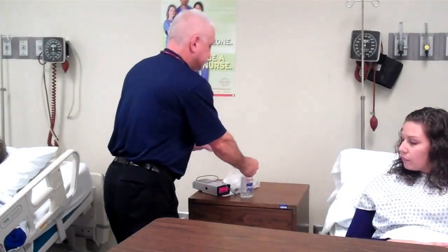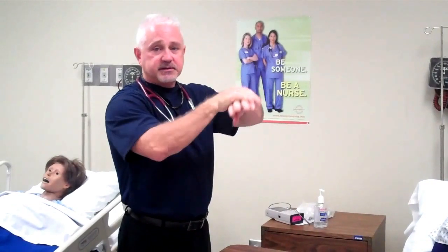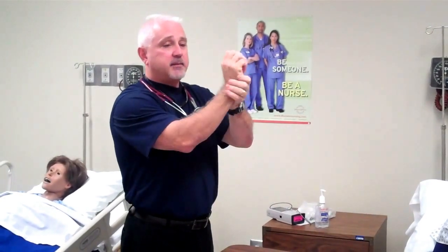First thing I'm going to do is wash my hands before touching the patient. If I use an alcohol-based hand rub, I'm going to have to make sure that I get it all around my hands, and then they have to air dry. You do not want to dry them with a paper towel or anything; they have to air dry.